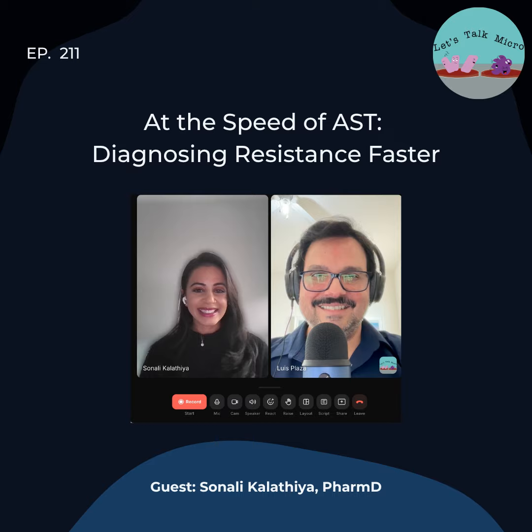And then I think another big thing is cost justification, right? There's still a growing body of evidence to demonstrate the clinical utility of these tests, but it's still relatively new. And so justifying the cost of bringing something like this on, given it's complementary and not replacing a test, is something to consider as well.